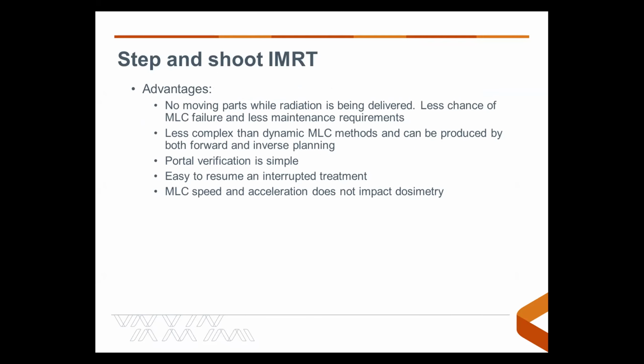So the advantages of this is that there are no moving parts while the radiation is delivered. Therefore, there is less chance of MLC failure, and this will then require less maintenance of your MLCs. It's a less complicated treatment than dynamic MLC, and therefore you can use forward planning and inverse planning. So forward planning, a typical field-in-field treatment technique for a breast treatment is forward planned.